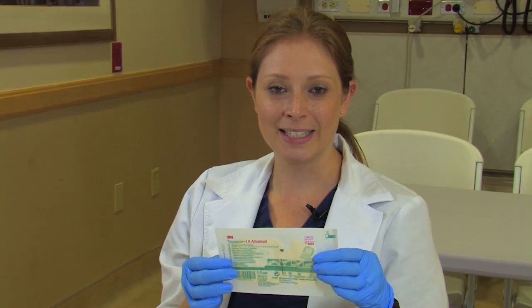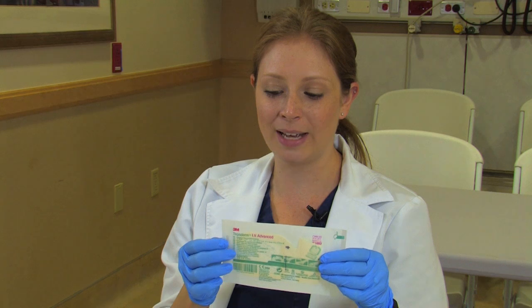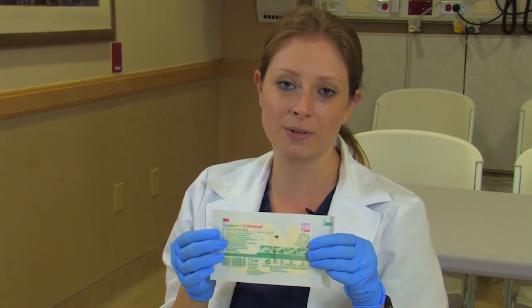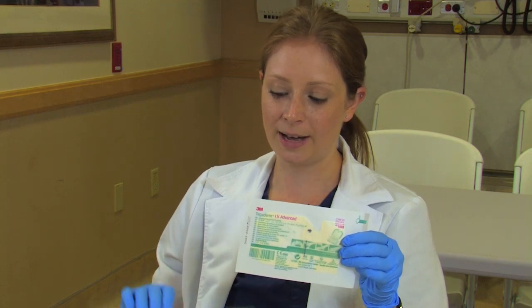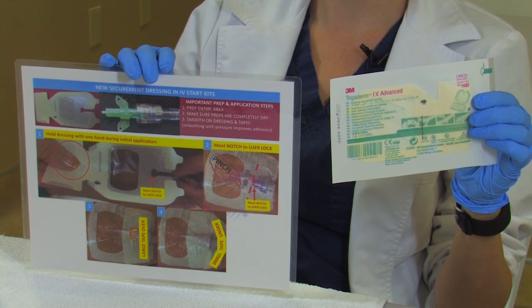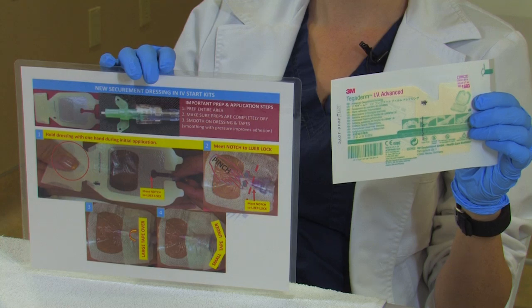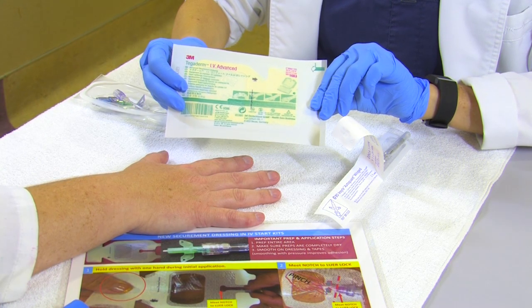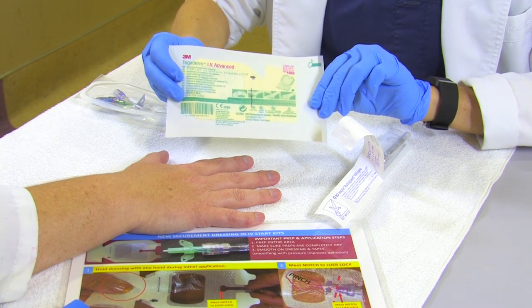Hi, I'm Rebecca, and today we're going to learn how to use the new 3M IV Securement device that's going to replace the barred Securement or the StatLock. We also have these posters on the floors that will show you how to walk yourself through it. In this demonstration, we're going to learn how to use the new IV Securement device, which is the 3M Tegaderm.